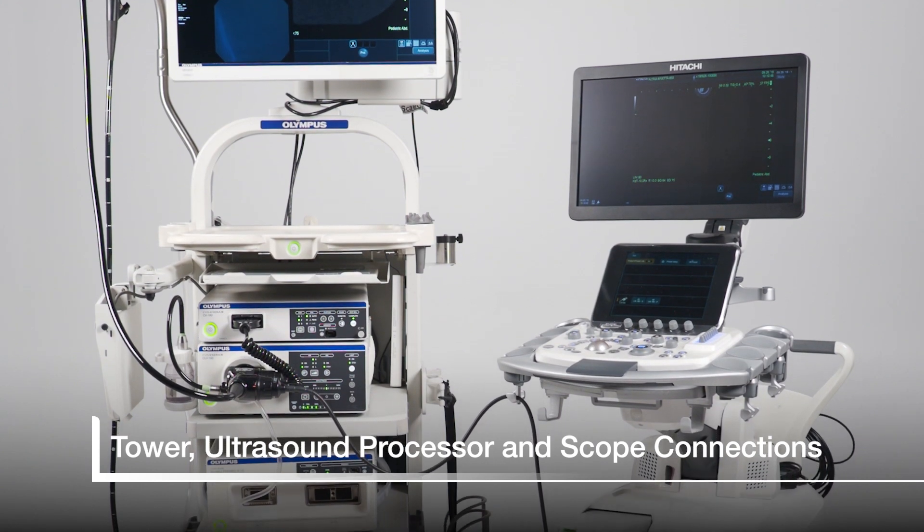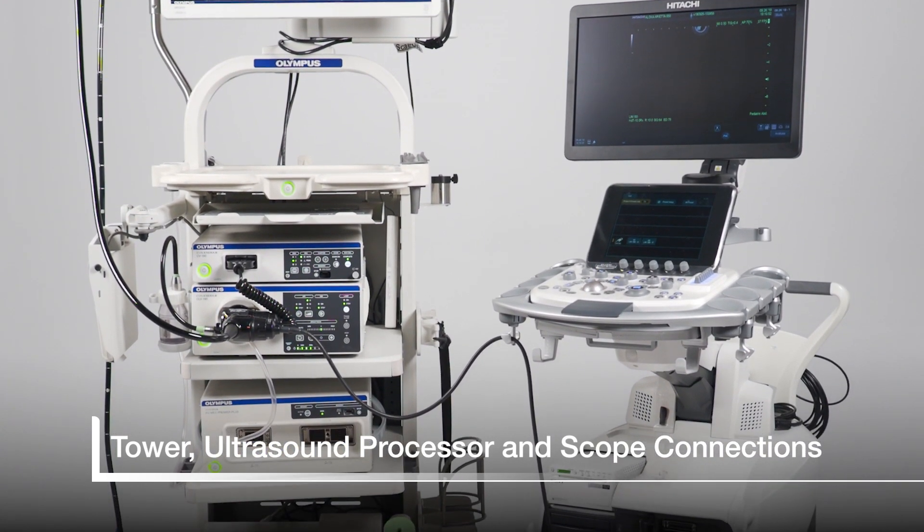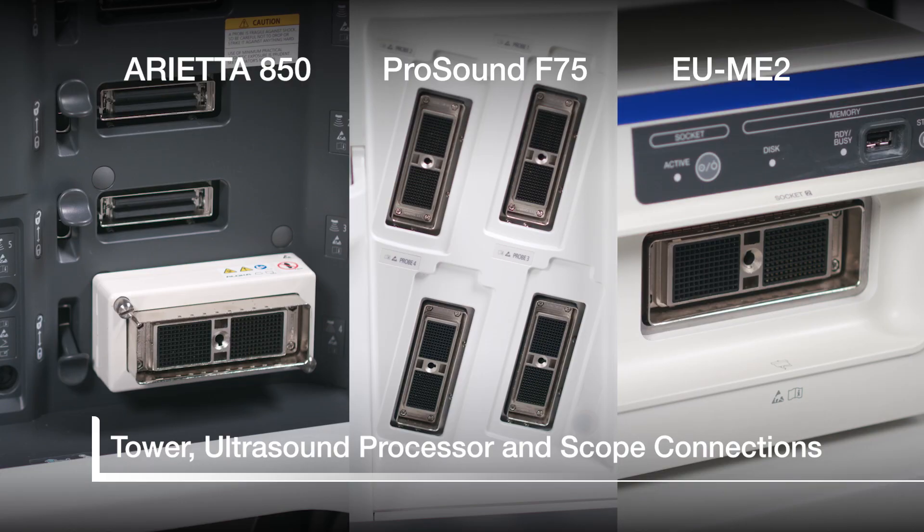This short video will demonstrate how to correctly connect echo endoscopes to both the EUS processor and the video tower. Let's begin by taking a quick look at the different EUS processors and their connection ports.